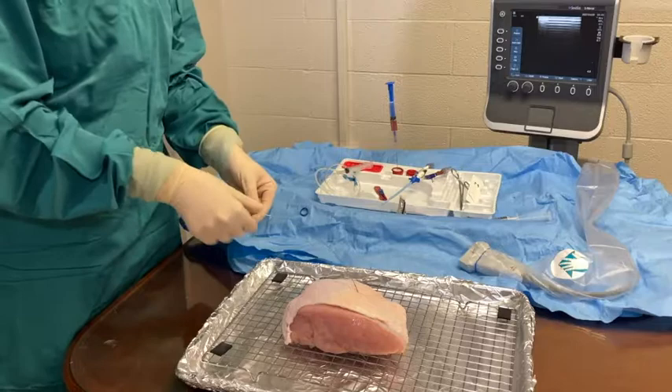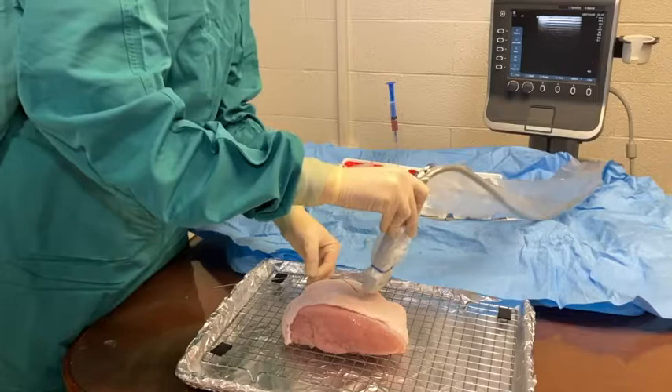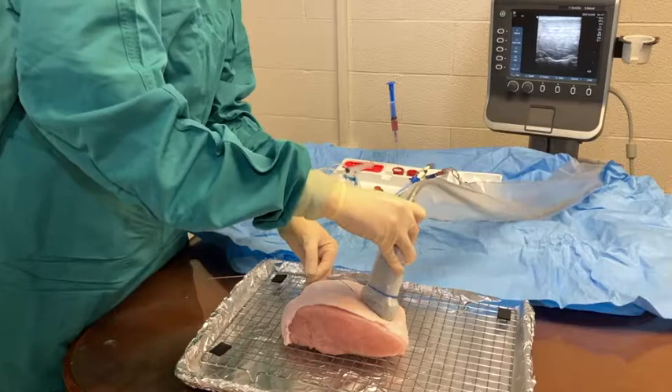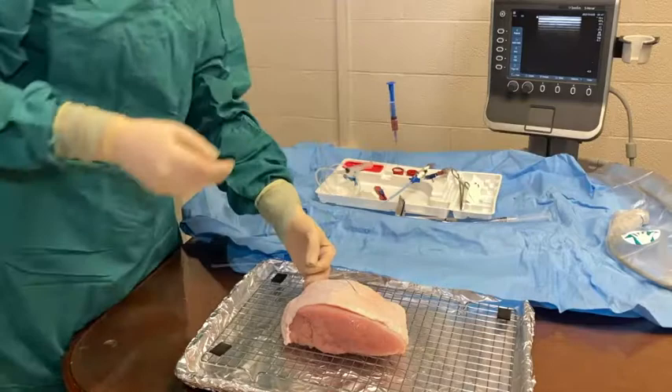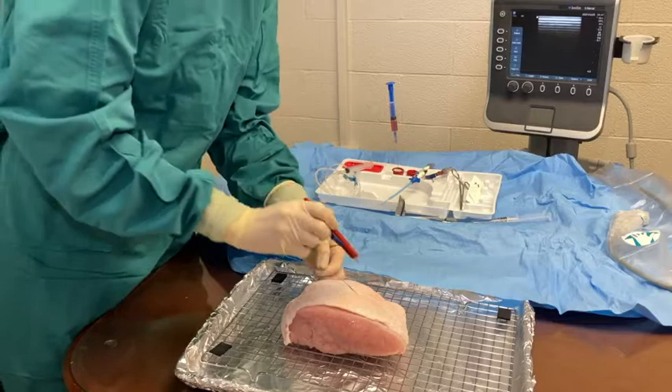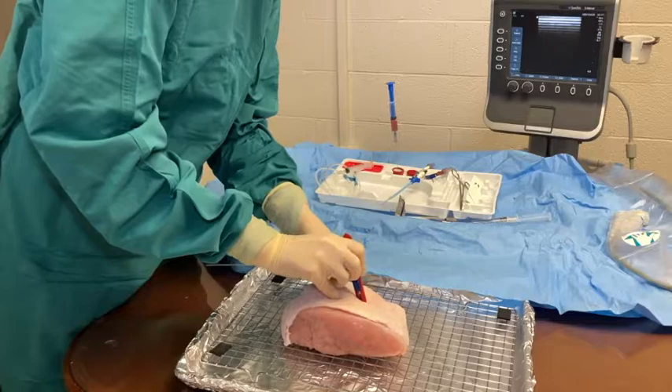Remove the angiocatheter. At this point, all that is left in the skin is the wire. Take the ultrasound probe to confirm wire placement in the internal jugular. Make a generous skin nick right where the wire enters into the skin to prepare for the dilator.